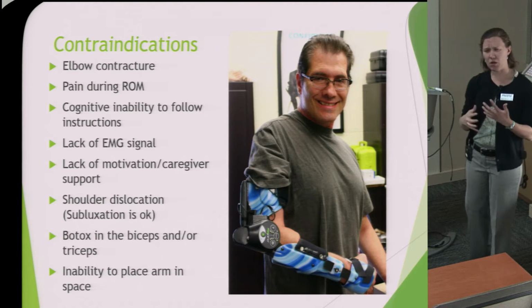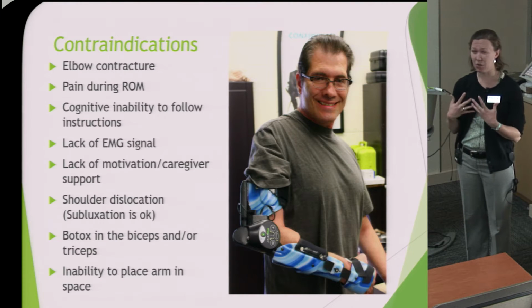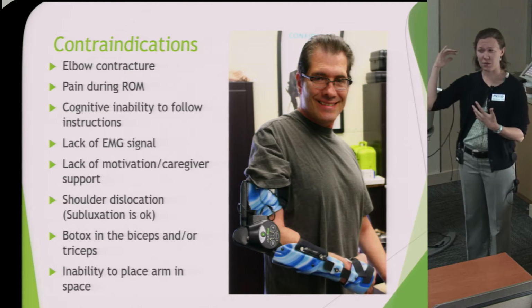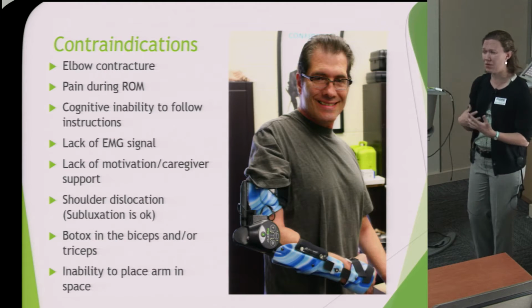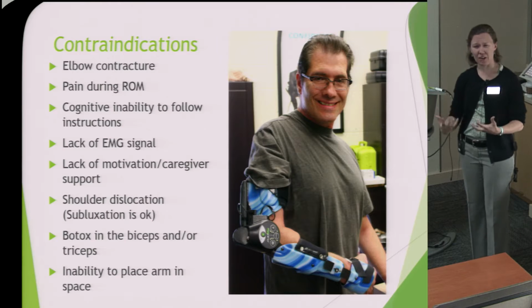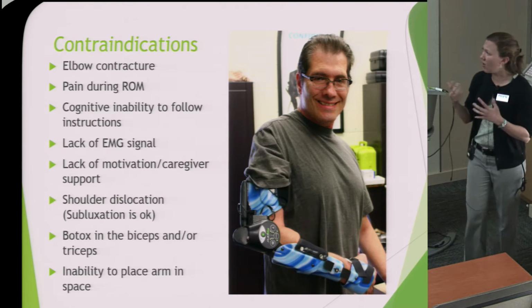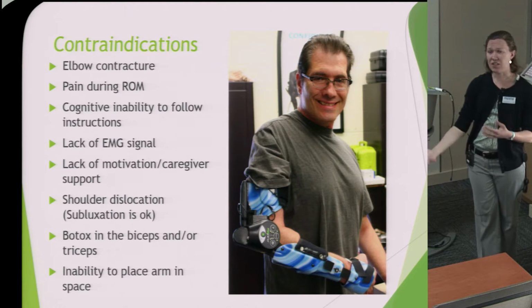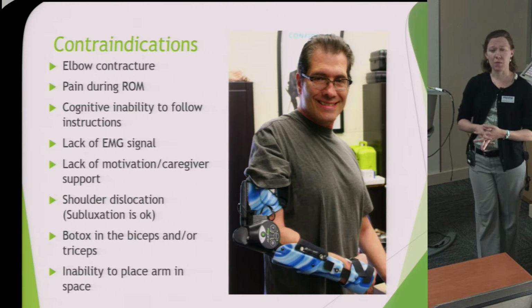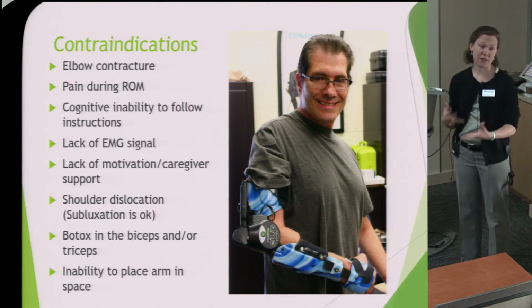We do have some small range of motion limiters on there. However, it does not provide a lock, so the device will still passively extend past whatever the contracture is. So it does tend to be painful, especially if they're carrying something heavy that wants to pull down on that arm. On that note, if they have any pain during range of motion, whether that's during flexion, extension, at the endpoints, whatever that may be, they're probably not the best candidate because it's just going to be uncomfortable every time they move their arm.